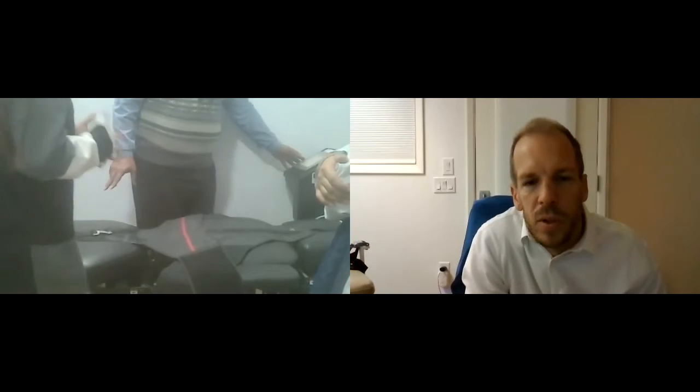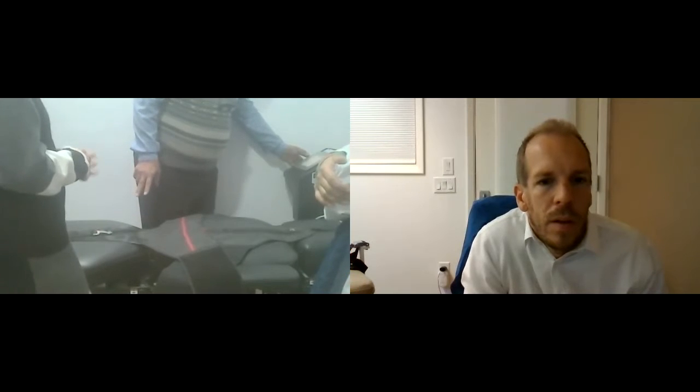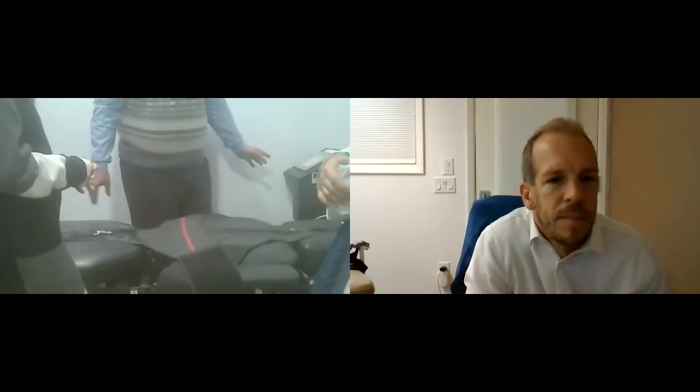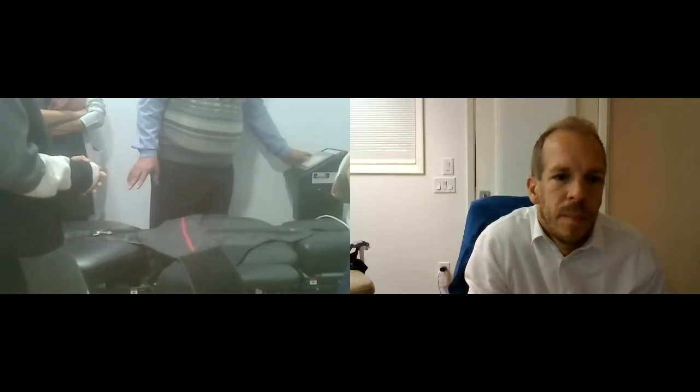On this table, you can actually go past neutral, so keep holding it down. I want to show you that you can put it into extension as well.